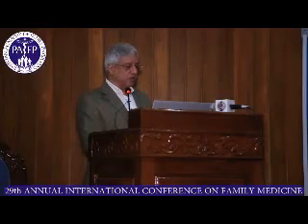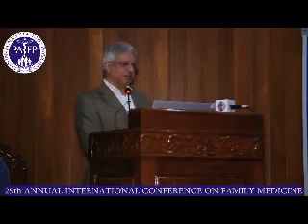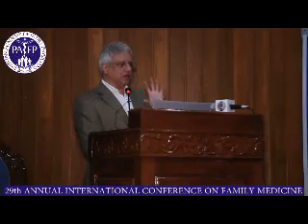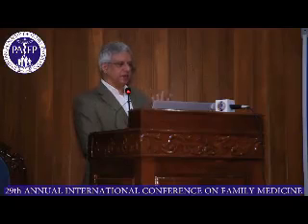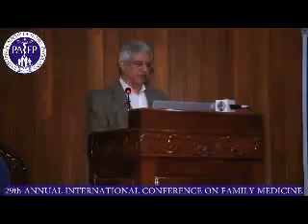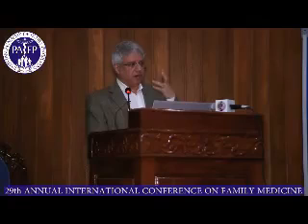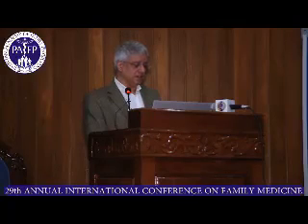Same stands true for the areas where you know a primary. So if you have a lung tumor and you want to image this patient, you can have either CT or MR, but the majority of the institutions, tertiary care institutions, will prefer MRI to look for metastatic disease rather than CT. And the reason is obvious, because MRI will pick up more lesions, decide on whether they are metastatic or not, or whether there are any other pathologies which can be labeled as dual pathologies. So MRI in all respects does better. That's why with known primaries you would do assessment with MR.